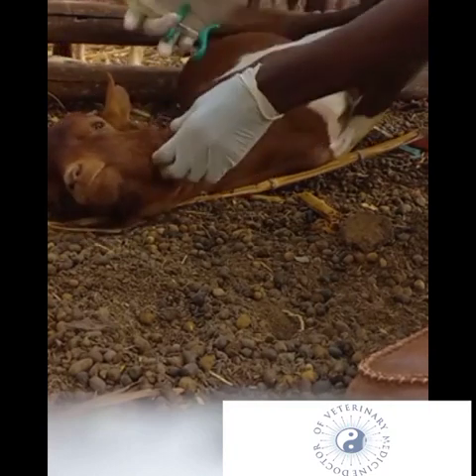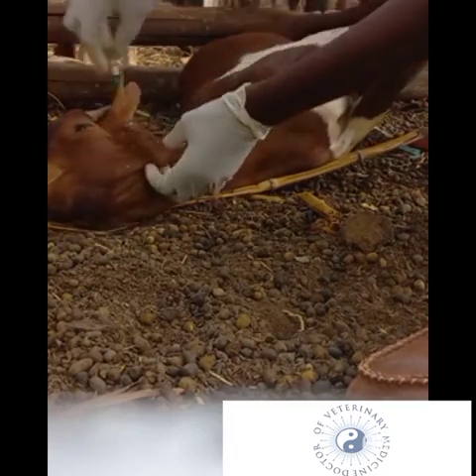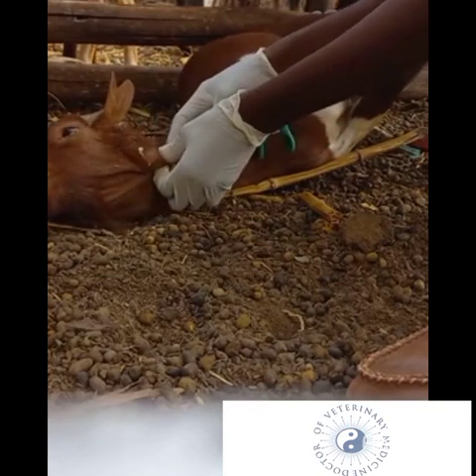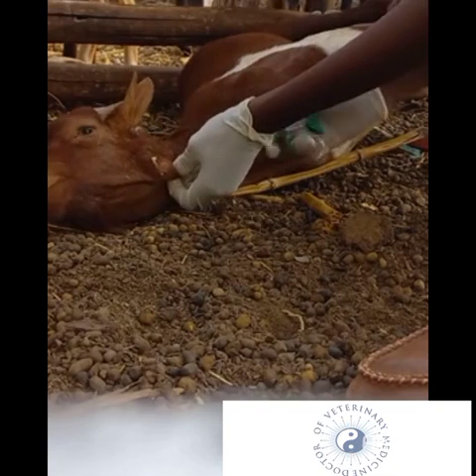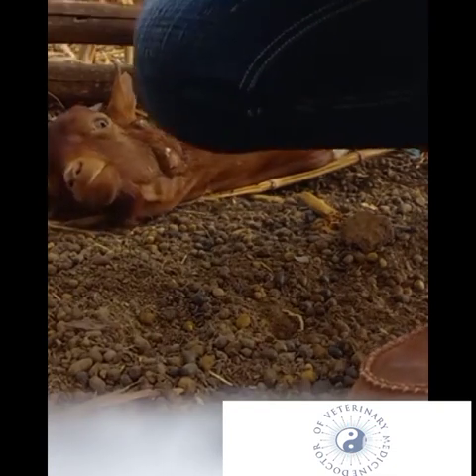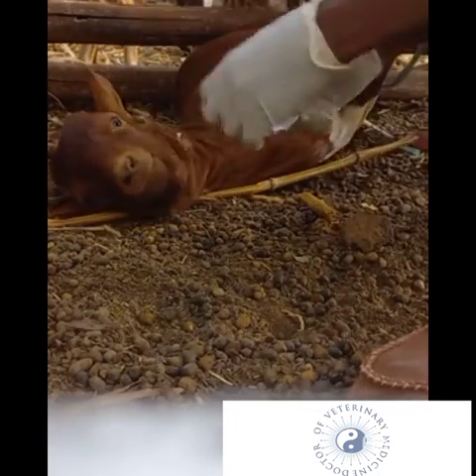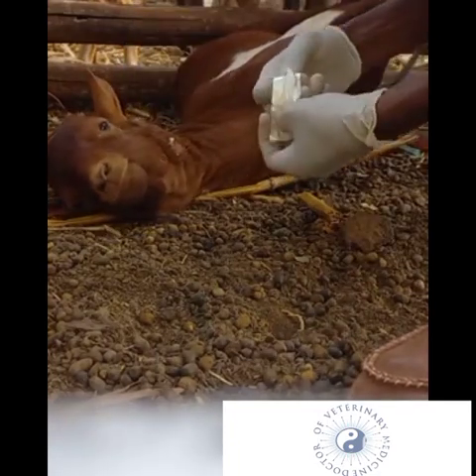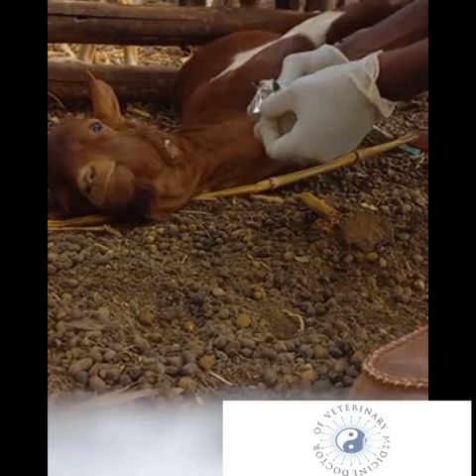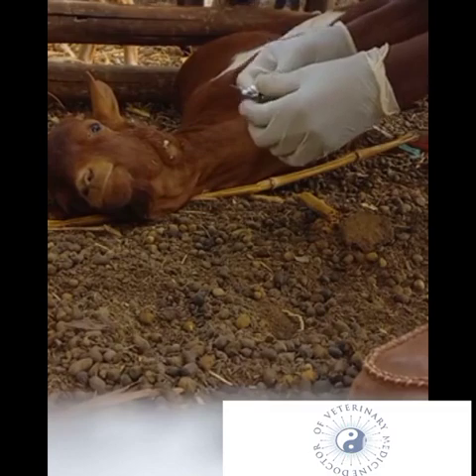I'm already complete with injecting the area. Okay, I'm preparing my surgical blade, the new one. I'm preparing the surgical blade there for incision.